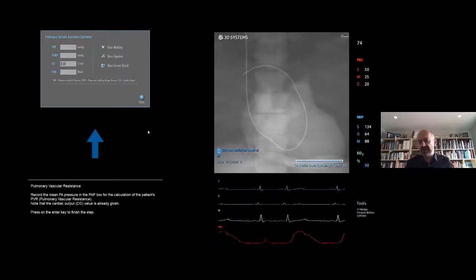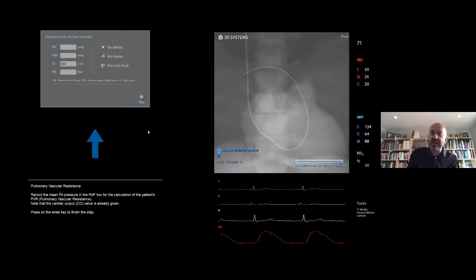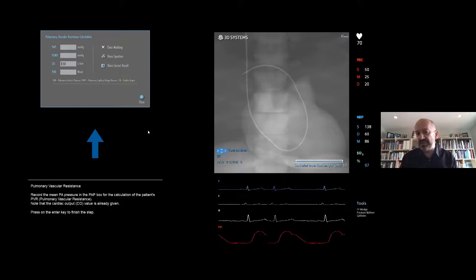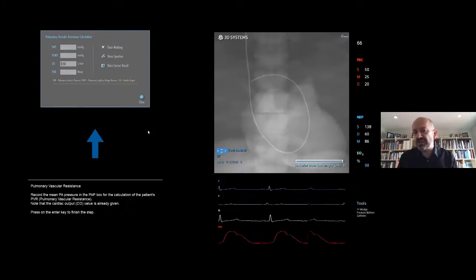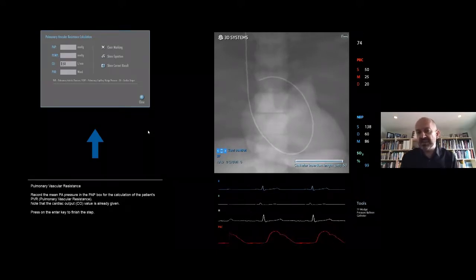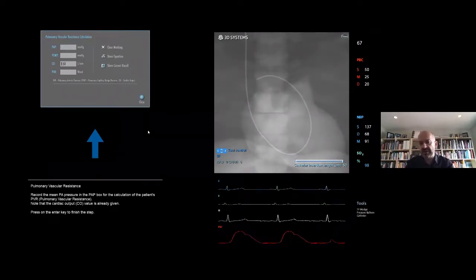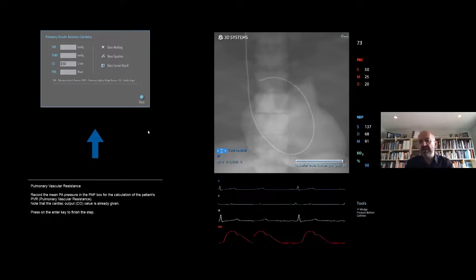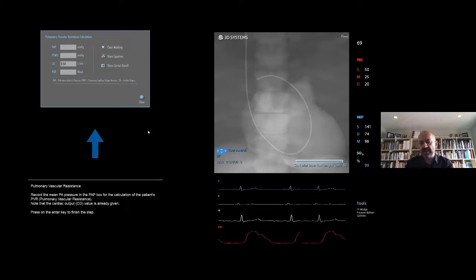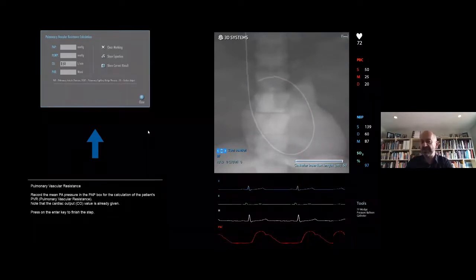So very important is to take the balloon down, and what you can do right now is pull the catheter back by about 2 or 3 centimeters. With Swans, I would just come back a little bit. You don't want to leave the catheter in too deep because it's a plastic piece of tubing. It'll get warm. It's like a noodle. The longer you cook it, the softer it'll get. And when the catheter gets soft at body temperature, it may migrate back and forth. So you're better off just pulling it back a touch. Then when you need to re-wedge it, you can always inflate the balloon and push the catheter in a few centimeters. That's not that hard to do.